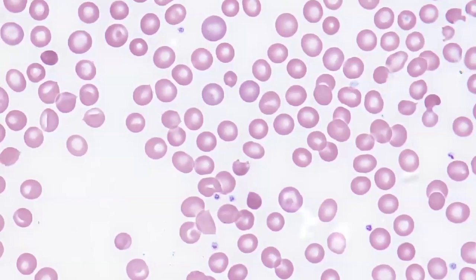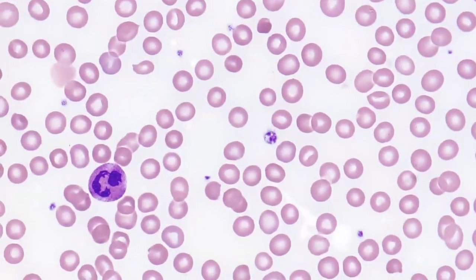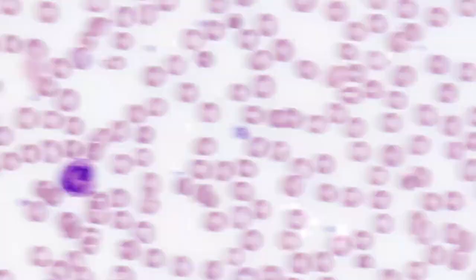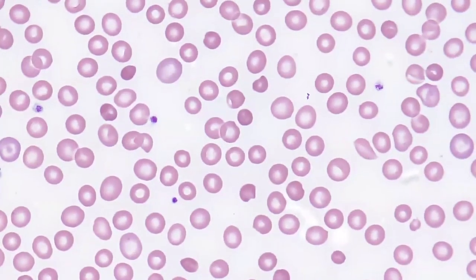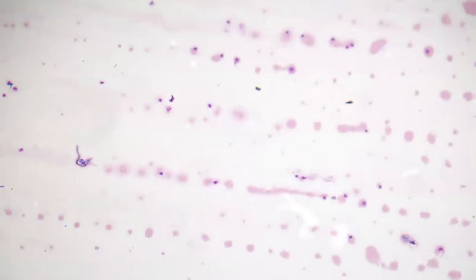severe liver disease. So as we move around, please note the different morphologies of these bite cells. In this case, the bite cells are relatively subtle, but we do see them in nearly every field. And lastly, we'll talk about schistocytes, or true red cell fragments.